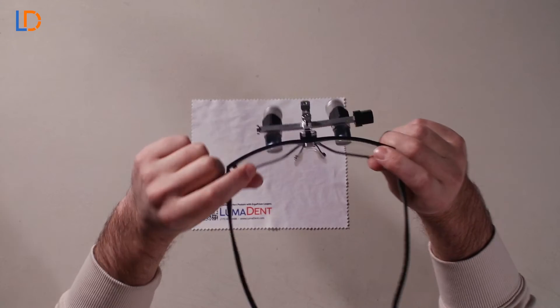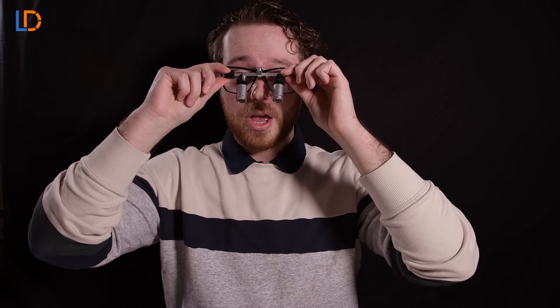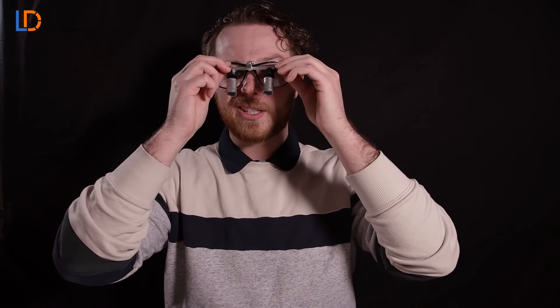Put on your pair of loops, and if you see shading you're going to want to turn the knob forward to move the ocular out. And if you see shading on the left you're going to turn the ocular backwards to move the ocular in. You're going to want to complete this step on both sides so your IPD is correct on both sides.